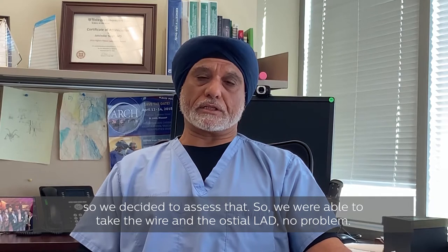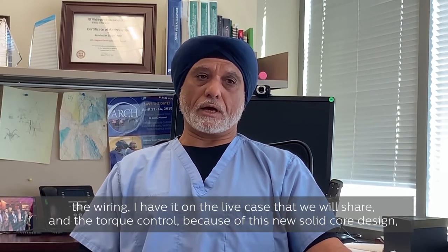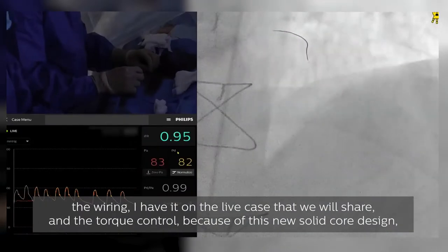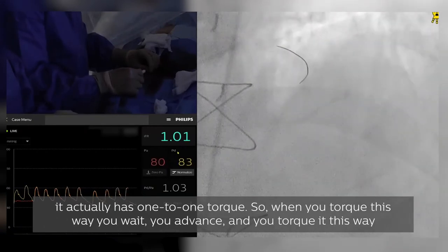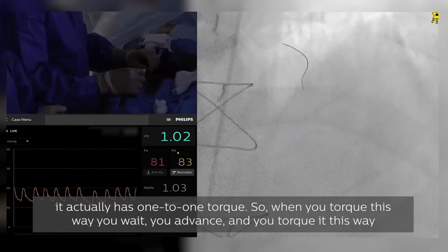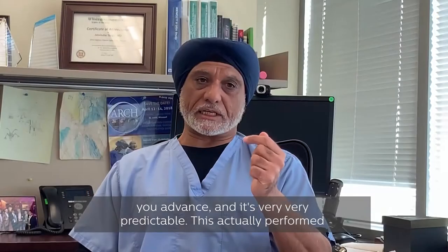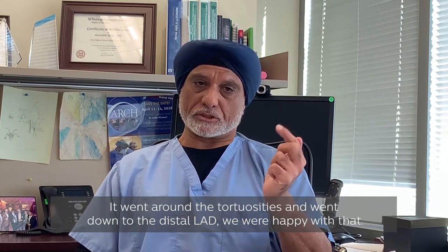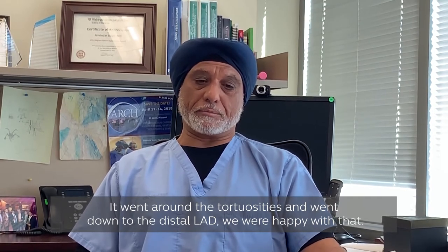We were able to take the wire in the ostial LAD, no problem. When we went into the mid LAD we thought we were going to have issues wiring it. Because of this new solid-core design it actually has one-to-one torque — when you torque it one way you advance, and the other way you advance — it's very predictable. This actually performed better than some of the workhorse wires, which was very impressive. It went around the tortuosities and went down to the distal LAD, so we were happy with that.